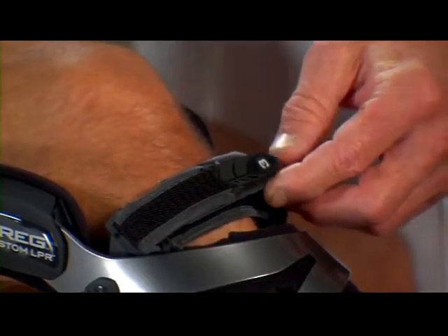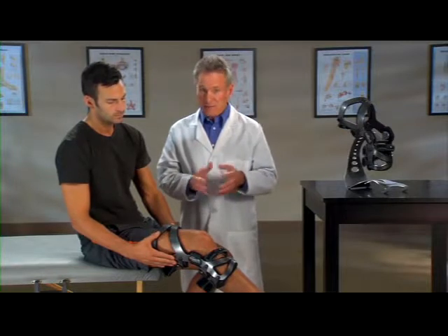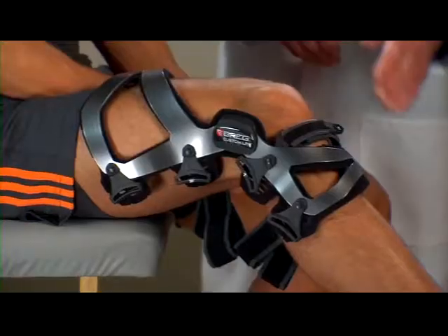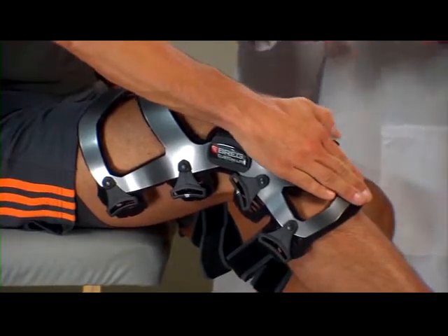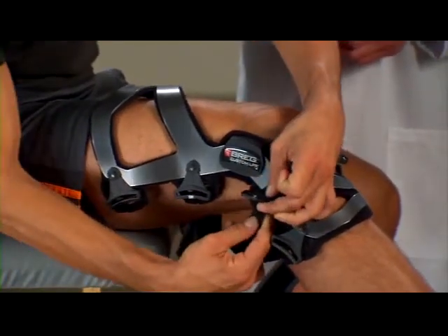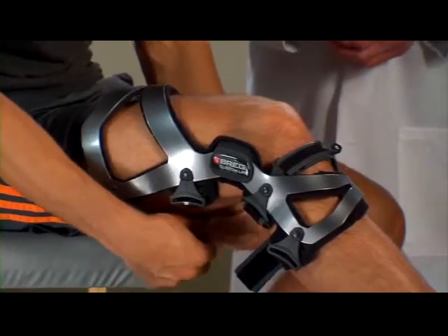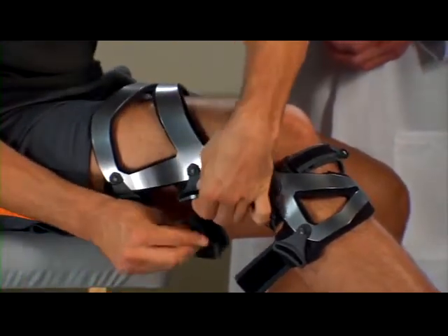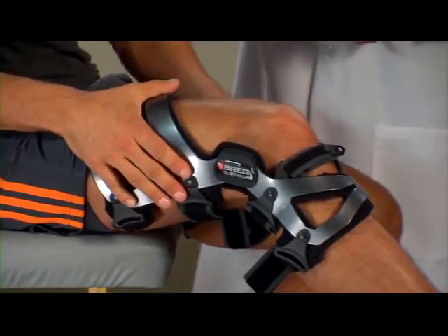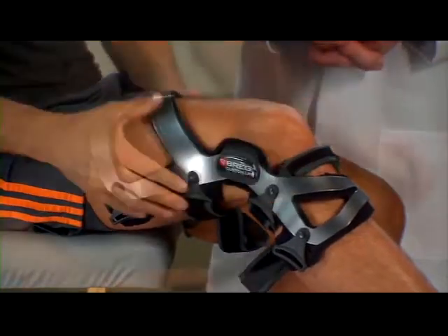Now we'll go through the strapping sequence. As you can see, the straps are numbered, making it easy to follow the correct order. As you go through the strapping process, make sure each strap is tightened snugly but comfortably, with equal tension so that no one strap is tighter than another. With the brace on your leg, press the shin cuff on the front of the brace flat against your leg and fasten strap one behind the calf. If the straps are too long, adjust accordingly. Fasten strap two in the back above your knee, making sure the thigh cuff on the front of the brace is pressed flat against your leg. Then fasten strap four in the back at the bottom of the brace.